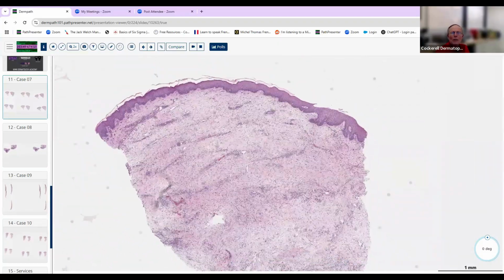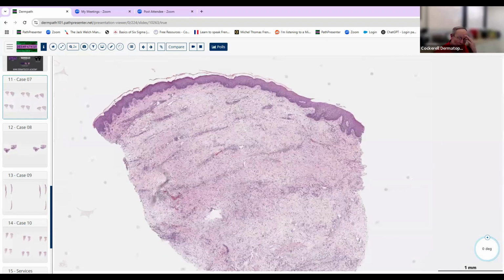So some people call this a so-called busy dermis differential diagnosis. That's fine. If you see the busy dermis, you want to ask yourself what kind of cells are there. Here we've got mostly neutrophils. I would ask myself, how busy is it? If it's pretty sparse, obviously that would tend to favor urticaria or urticarial allergic eruption, or maybe one of the autoinflammatories. If it's a little denser like this, start thinking more like cellulitis.